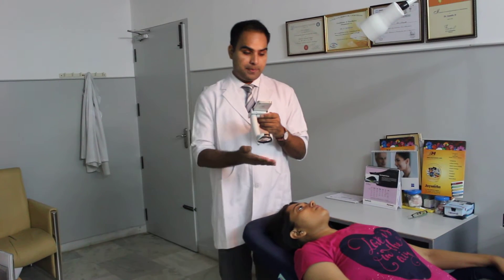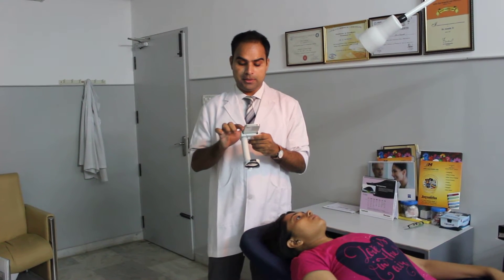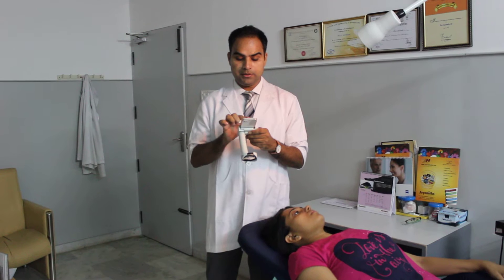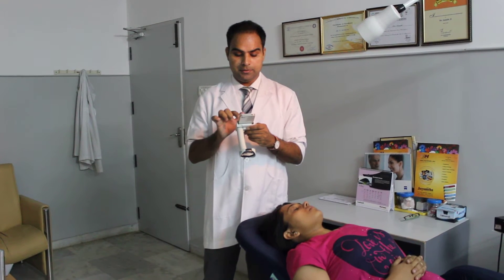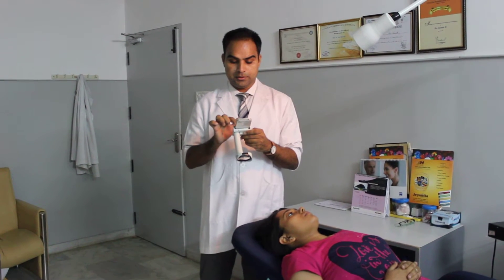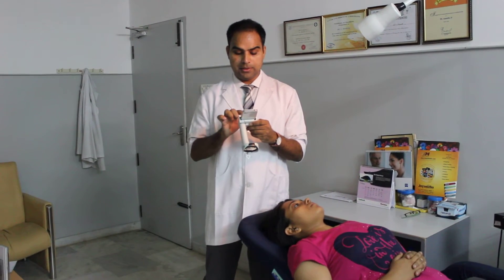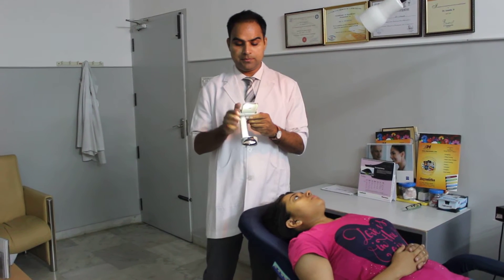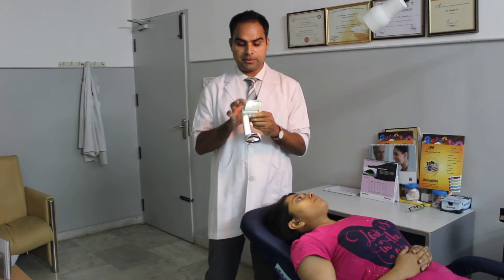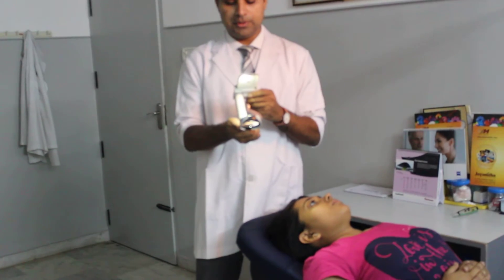Our patient is here and I'll tap on the MIRHK app to enter the essential information — the name of the patient and the MIRHK number and other information. Then I tap on the camera button so the flashlight comes on. I slightly zoom the screen so that the entire screen is full of the lens and adjust a little so that we are right in the center.